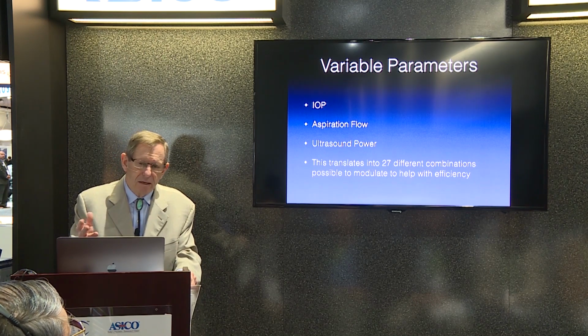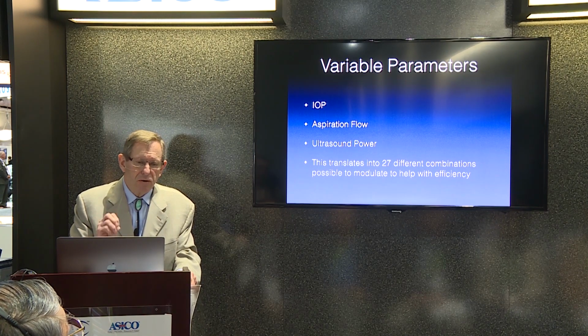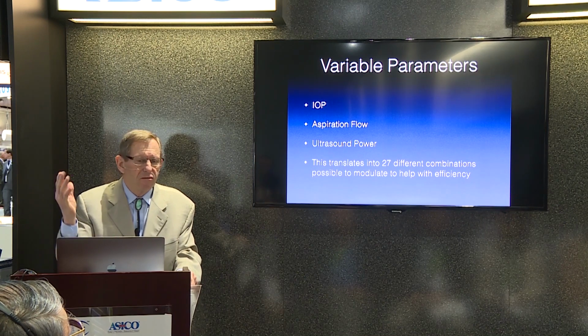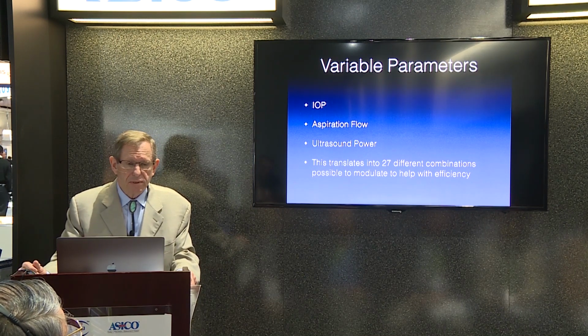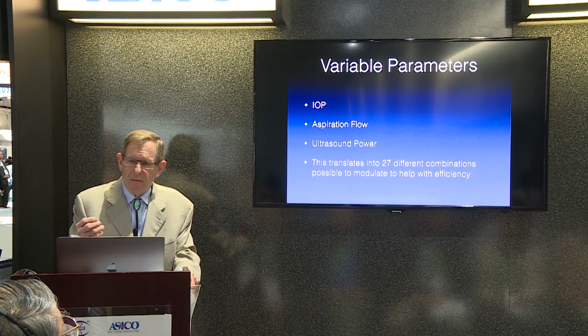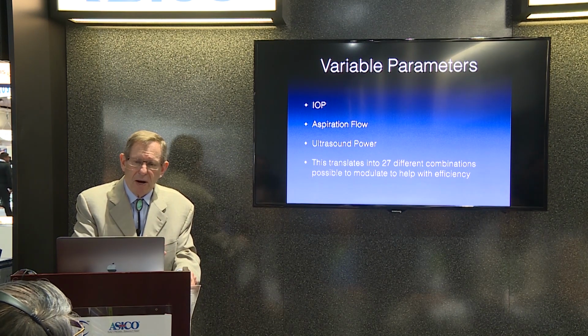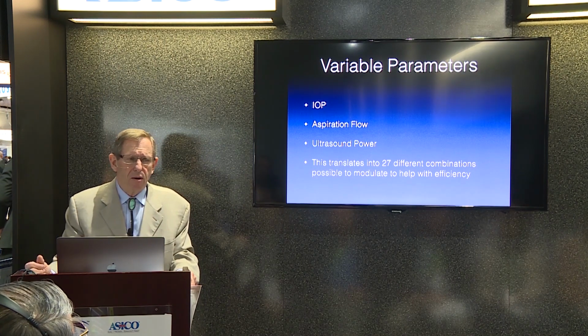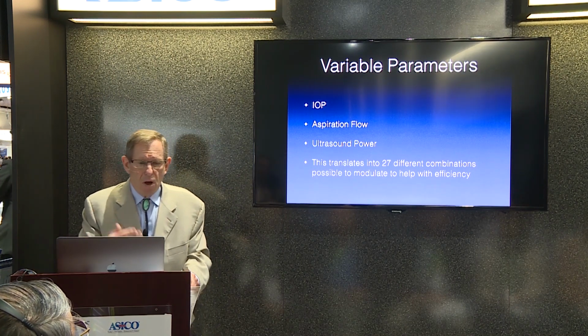And then once you start the case, you could just say, hit my Phaco setting for posterior polar, and it's right there. And then you can modulate within that by telling them, okay, actually this one I want lower power, this one I want higher fluctuation, this one I want to change my power, my on time, off time.